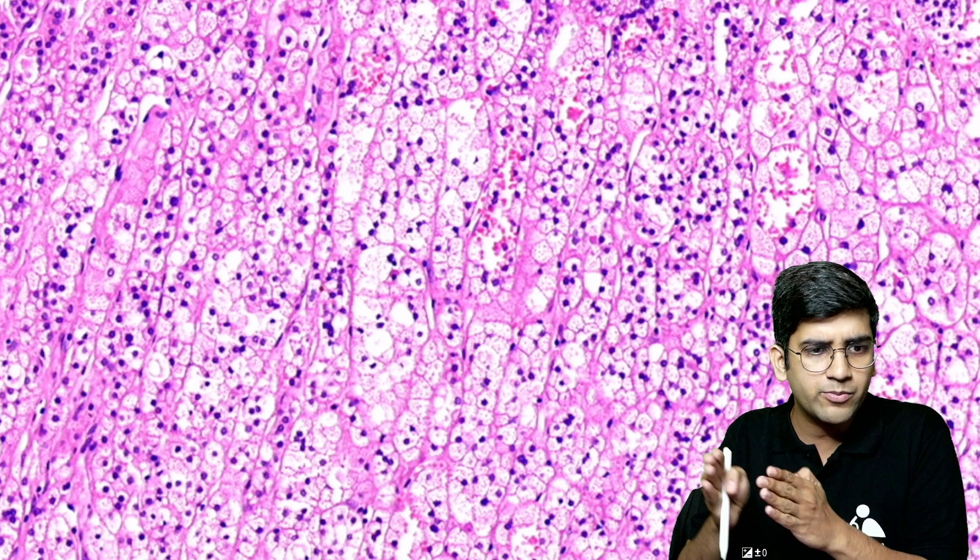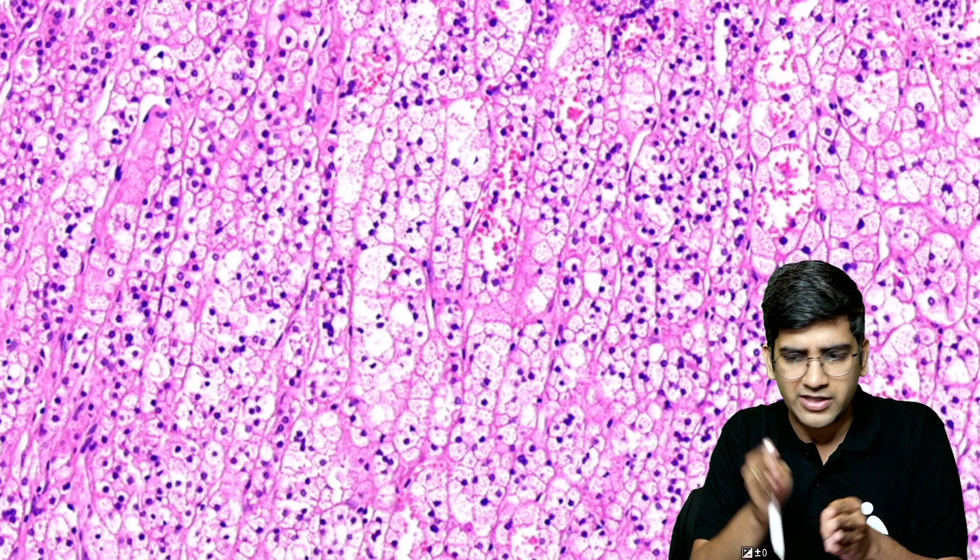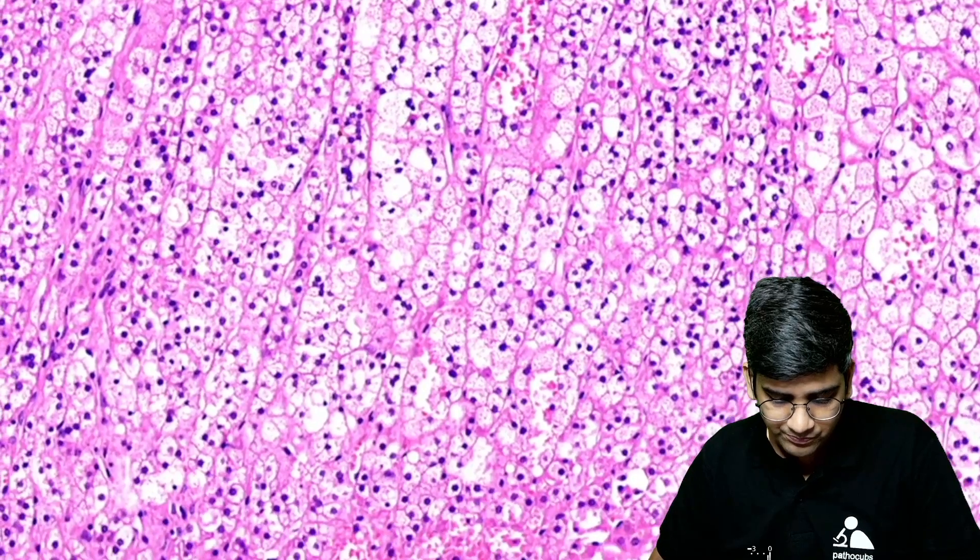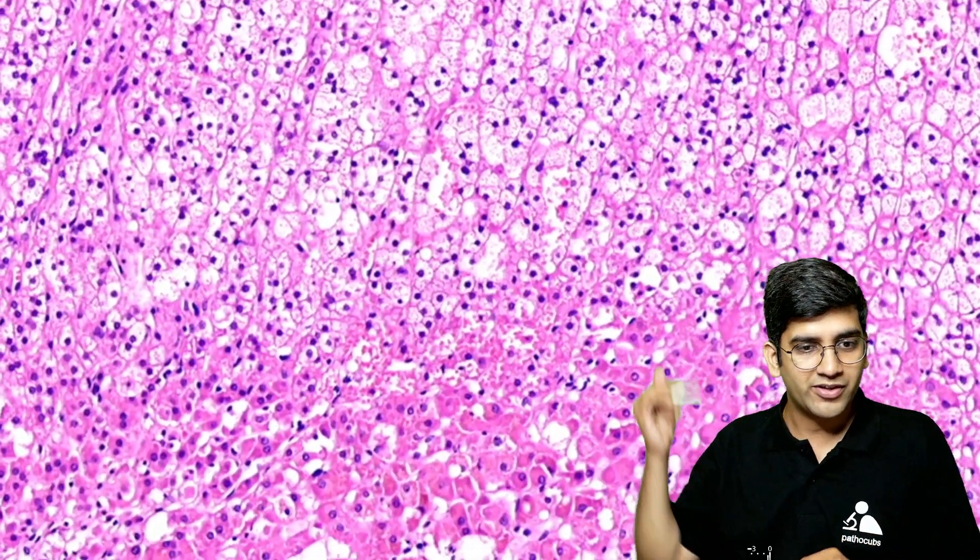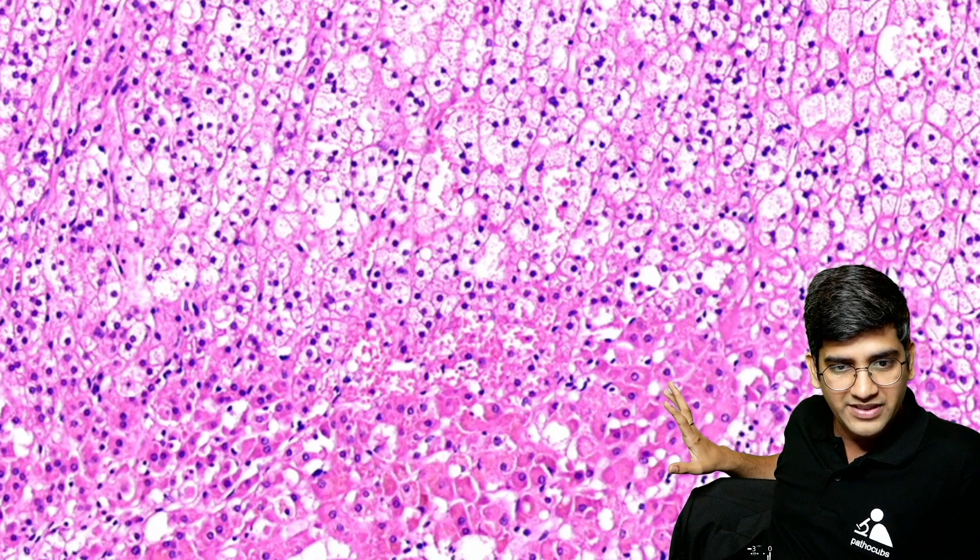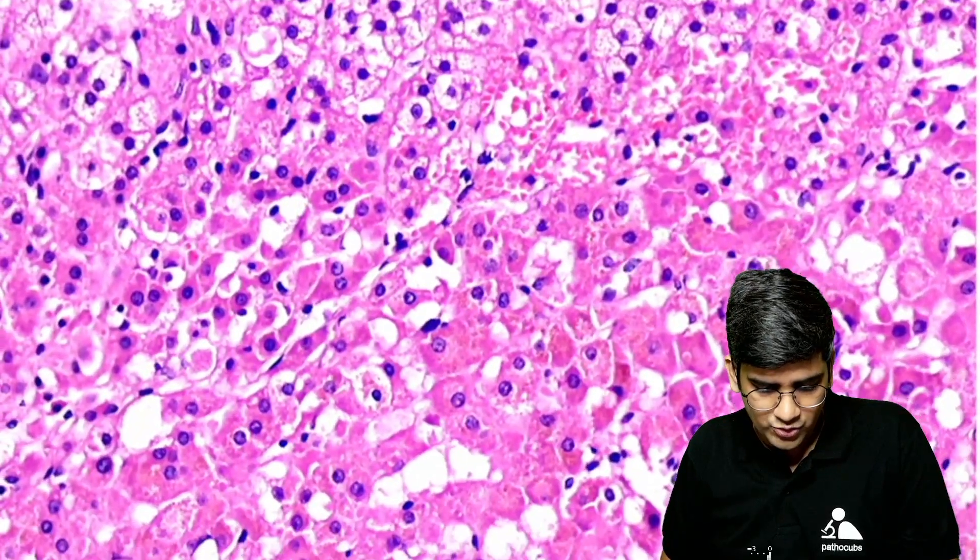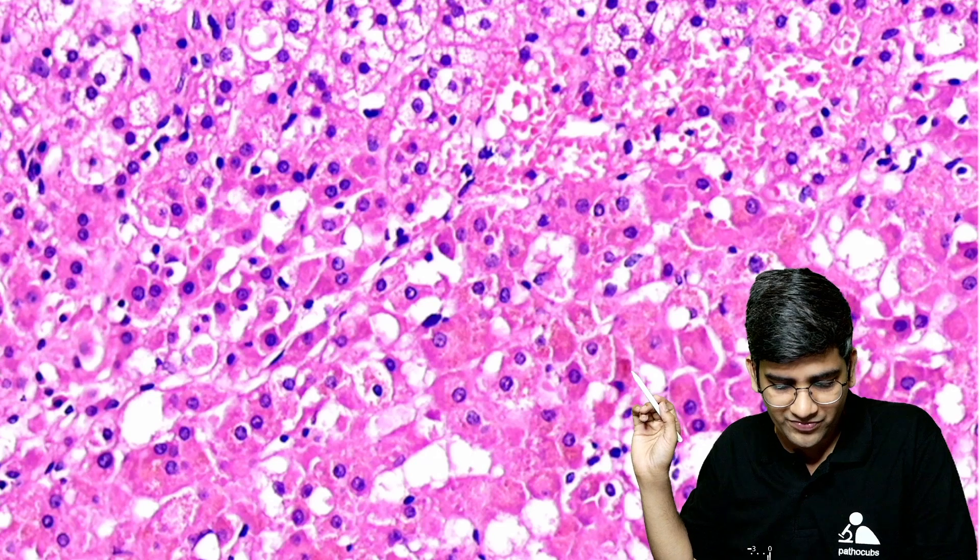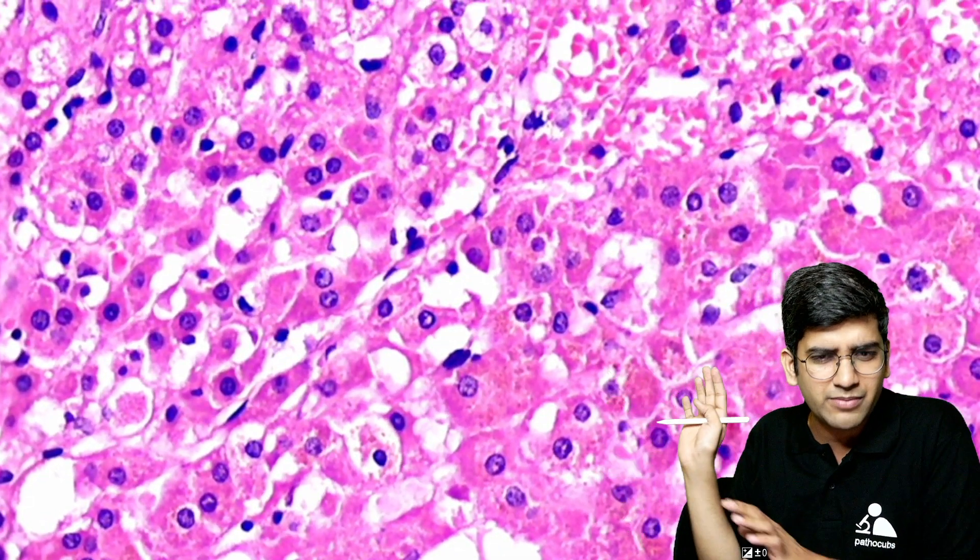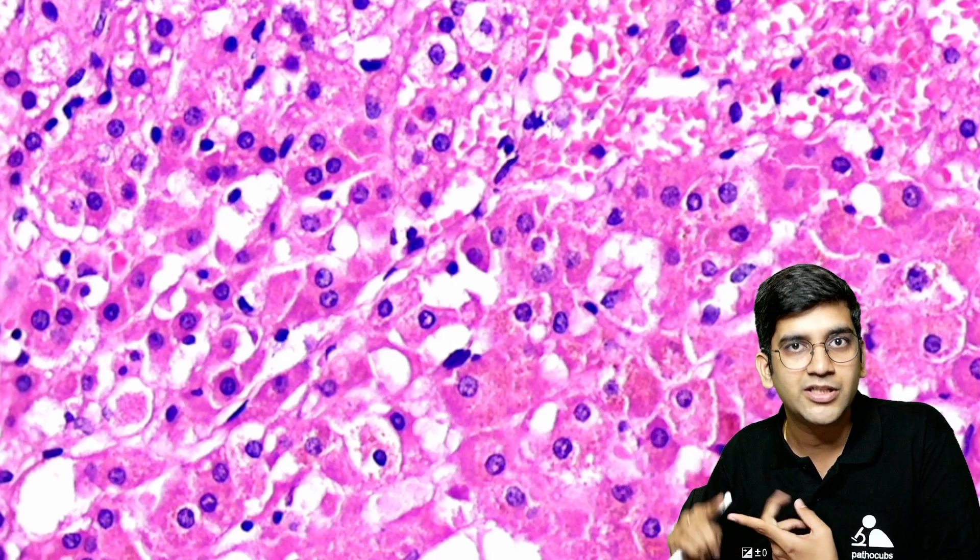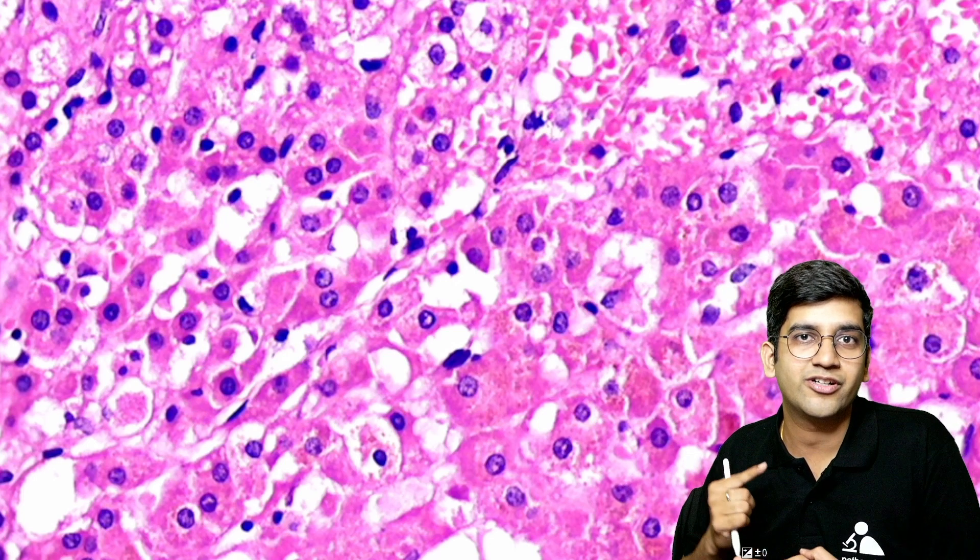You can you can see them it's trabeculae and each trabeculae will have two cell thickness that's classical for fasciculata you have to know the normal. Look at every trabeculae it will be perfectly two cells a trabeculae two cells a trabeculae. When you go a little bit deep down I'm sure even in this low power you can differentiate the color. I have a clear background here clear cytoplasm you have pink cytoplasm here. If you zoom in a little bit look at this the cytoplasmic granules. I'll zoom in a little bit more maybe it'll become a little bit burnt but but it's fine. Can you appreciate the lipofuscin the pink cytoplasm the lipofuscin classical for reticularis.